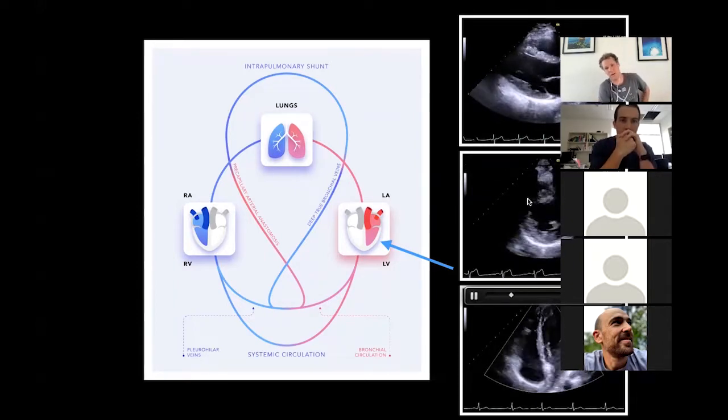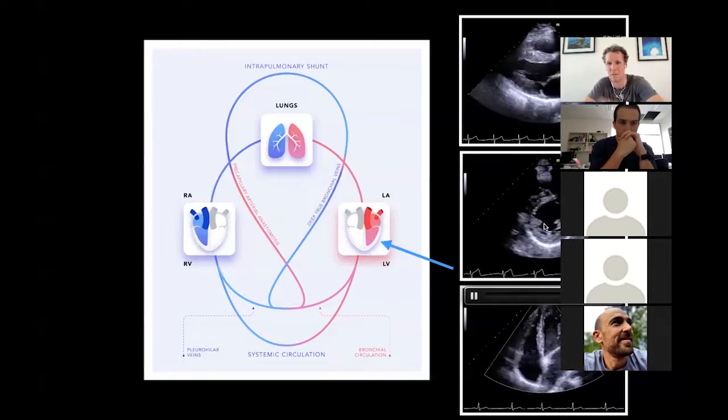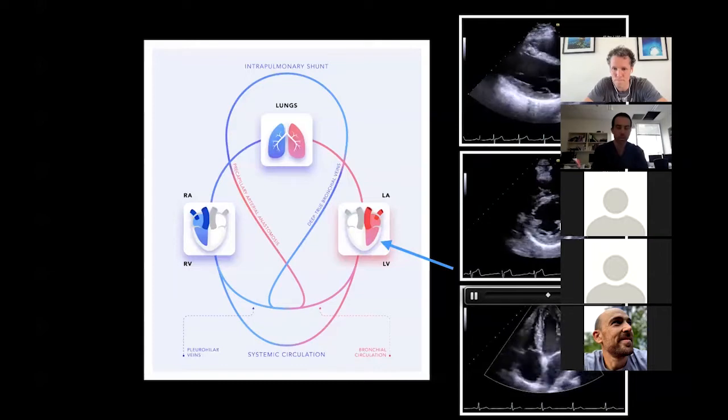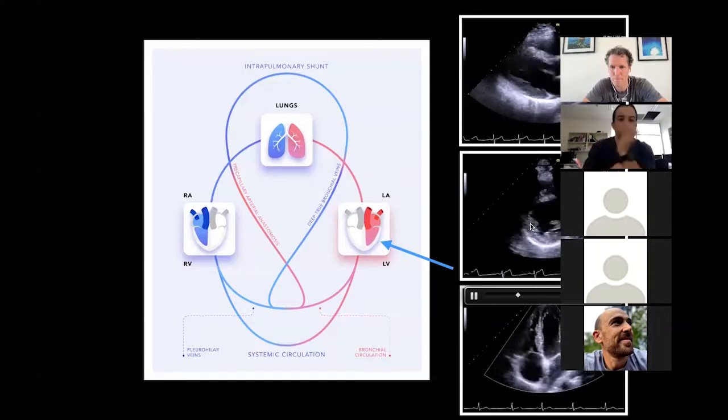All right, Vishal, if you've got the short axis view here, what are the two papillary muscles called and what's their blood supply? So anterolateral and posteromedial. Anterolateral there's a dual supply, LAD or circumflex. Beautiful. And whereas the posteromedial, there's only one blood supply, either RCA or circumflex.